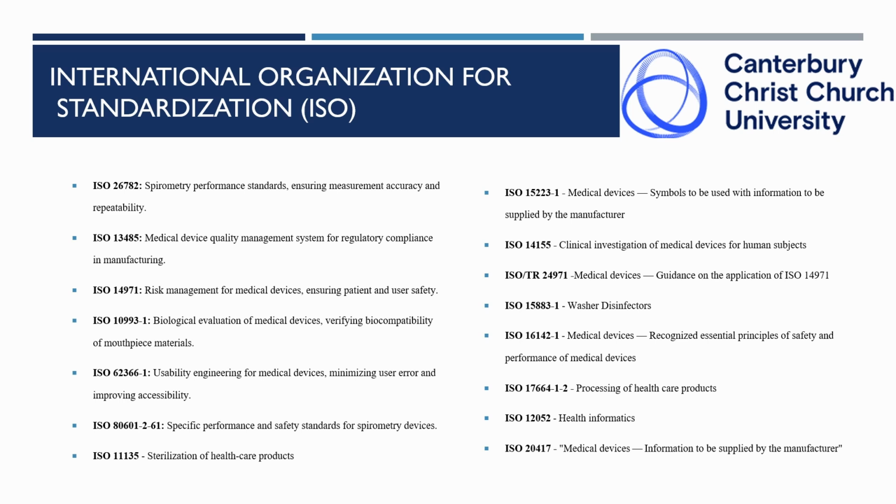Now, we come across a very important slide discussing the ISO standards, International Organization for Standardization. When developing a medical device like this spirometer, it's crucial to adhere to established standards and regulations. These guidelines are in place to ensure the safety, effectiveness, and quality of the device. Here's an overview of the key areas they address.